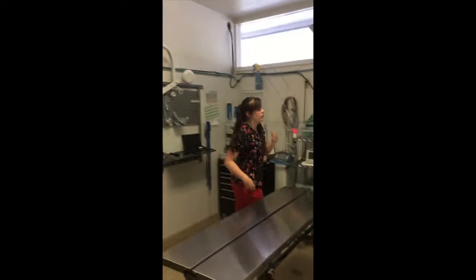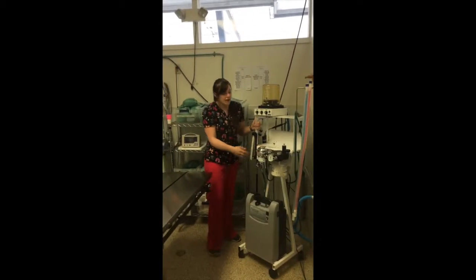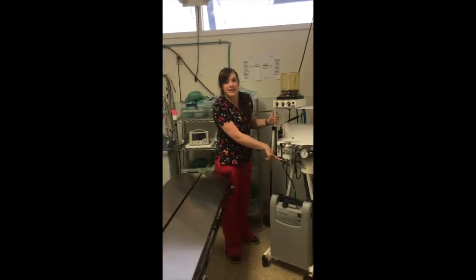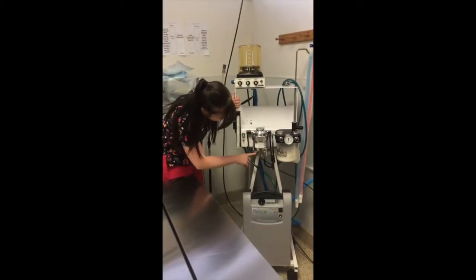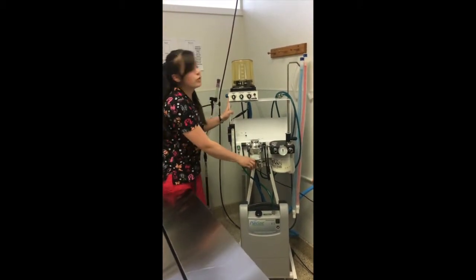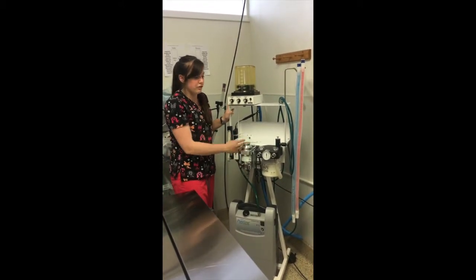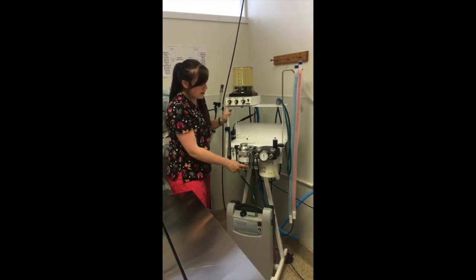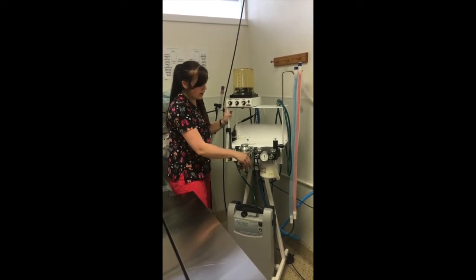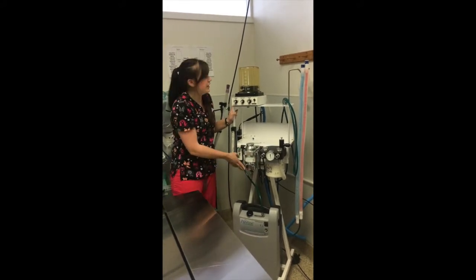At the end of the day, you always want to make sure that you refill your isoflurane. We use isoflurane here, your liquid anesthetic inhalant. So you can see that our machine is full. It's all the way up to this top line here, so we don't need to fill it up today. But at the end of the day, you always want to check that and make sure that it needs to be filled. If it is empty, the reservoir is right here, and you just pour your inhalant inside that reservoir until the liquid reaches the top line of the gauge.